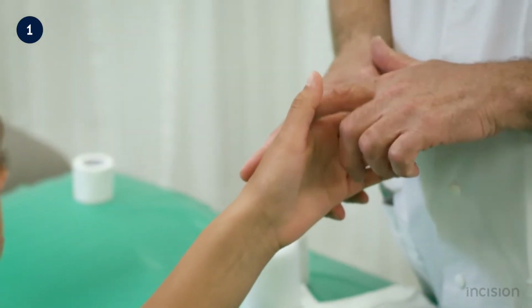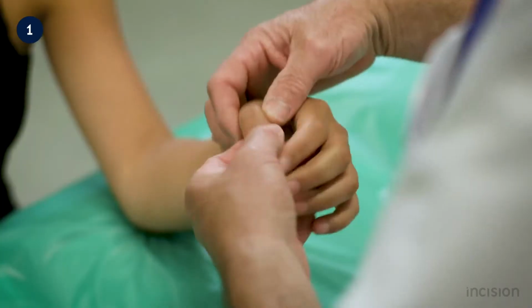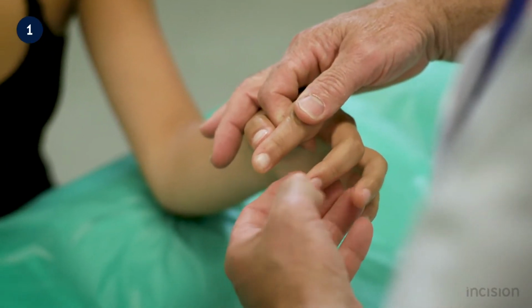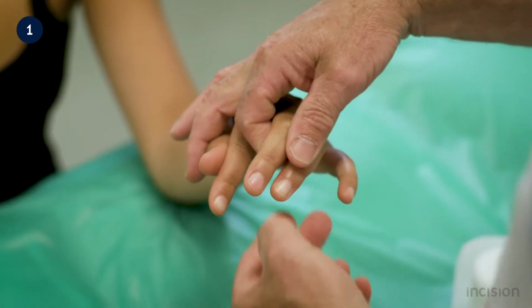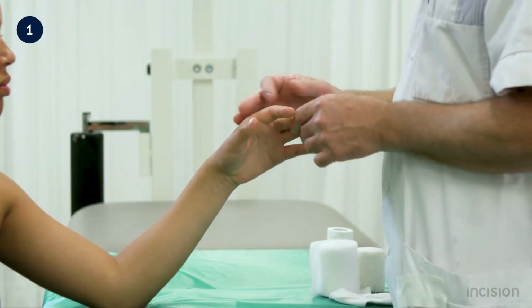The sensation in the thumb and other digits is examined, as is the capillary refill. All these examinations are used to detect abnormalities so they can be acted on if necessary. Also, the results can be compared to the physical examination after the splint has been applied.